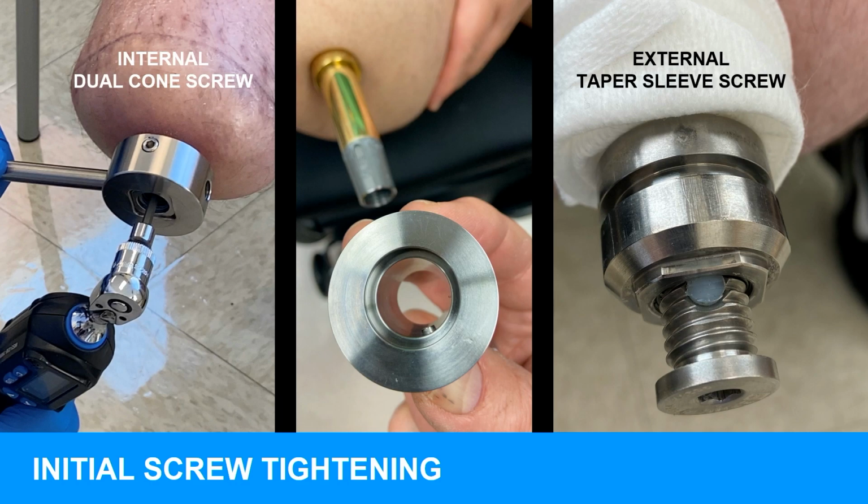A click torque wrench isn't very friendly. It's almost like you're not really thinking that osseoperception could be a problem. When you use a click torque wrench, it usually vibrates straight up to their teeth. So we like to use a digital torque wrench.